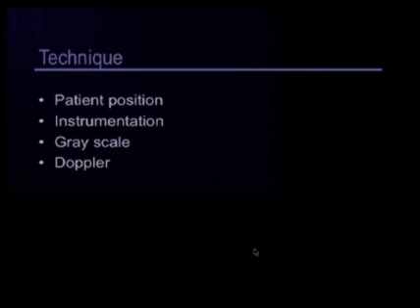Okay, the patients may be scanned supine or standing or sitting up. We can have their legs dangling over the edge of the stretcher, and we usually position their legs in a semi-frog leg position.